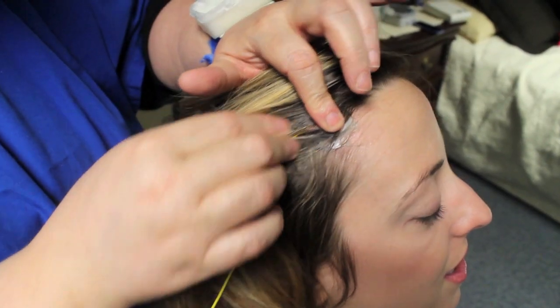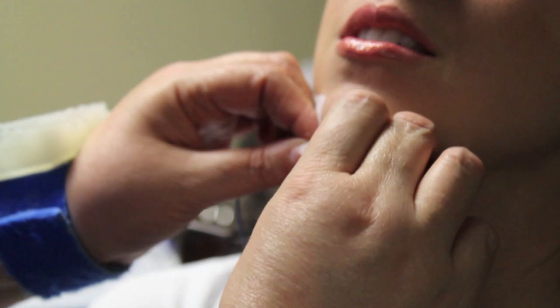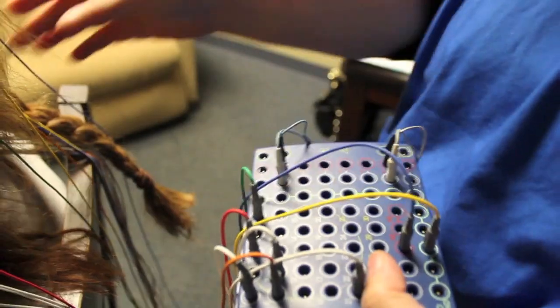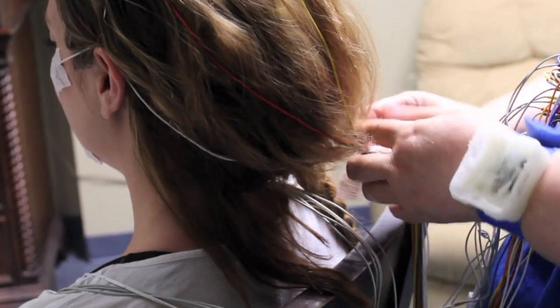The sensors on your head include two sensors by your eyes so that we can see rapid eye movement sleep. You'll have a sensor on your chin so we can see muscle tone and whether you're grinding your teeth. There's a snoring microphone, and there's another sensor to check for airflow. You'll also have on two belts to see whether or not you're trying to breathe.